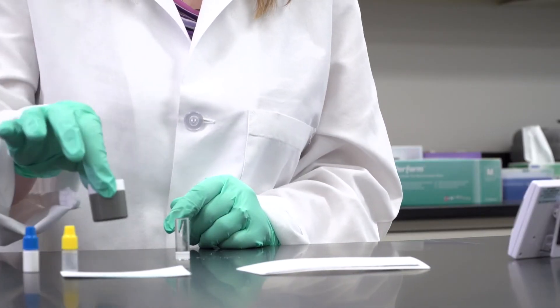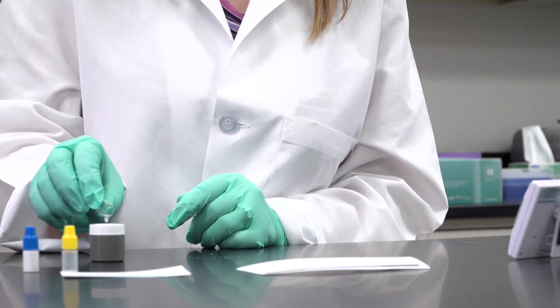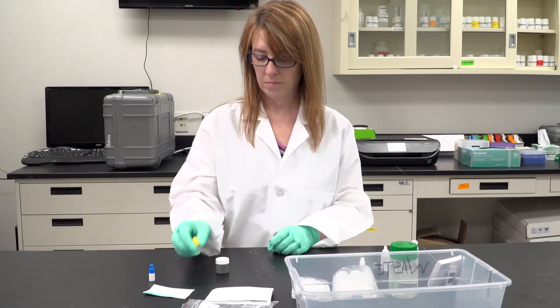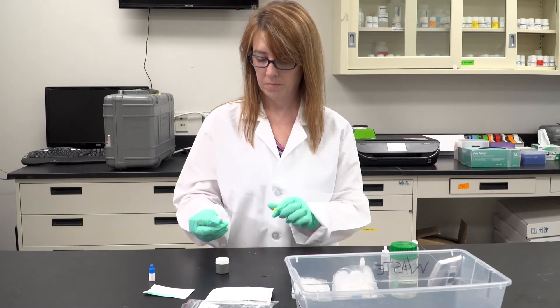Pour contents of immunoreagent vial onto test membrane device and wait until all liquid is absorbed through the membrane. Squeeze wash solution onto test membrane device and wait until all liquid is absorbed through the membrane.